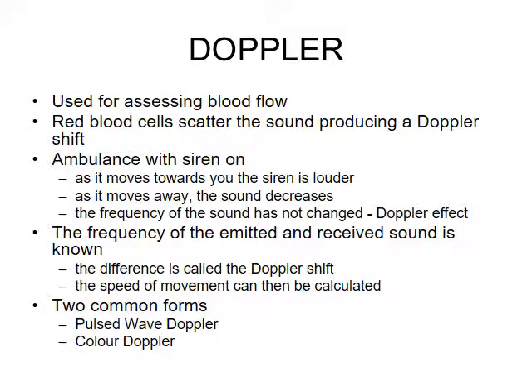Now in physics, you've probably also learnt and heard about Doppler. And Doppler can be very confusing from the physics side to understand, but what I'm going to explain here is how we actually use it, and we use it mostly to interpret blood flow within vessels.